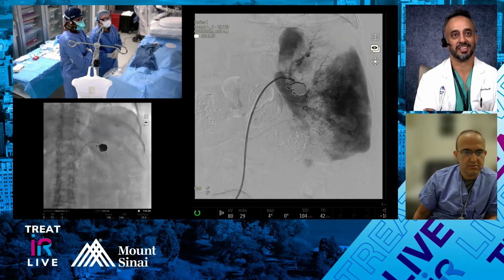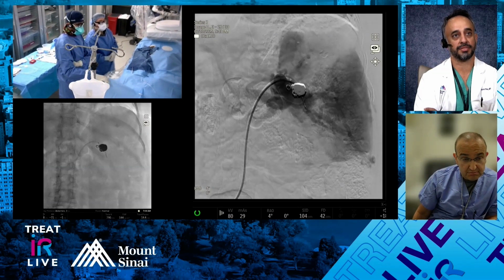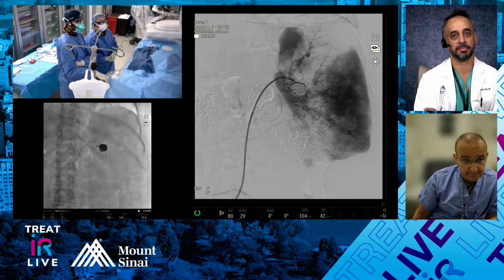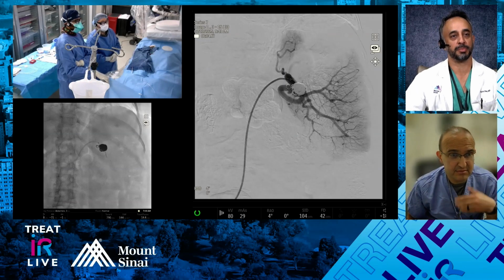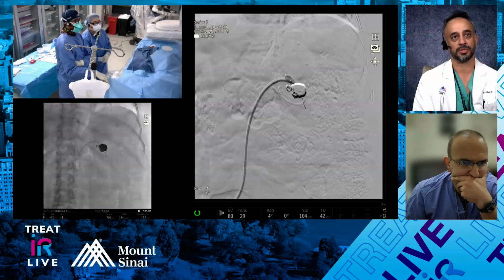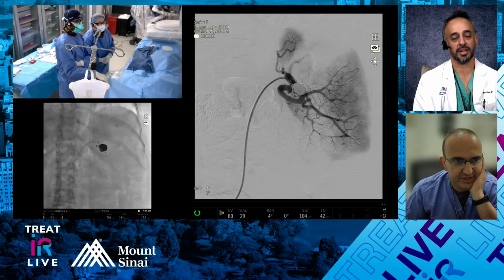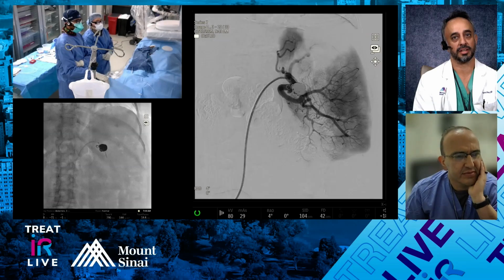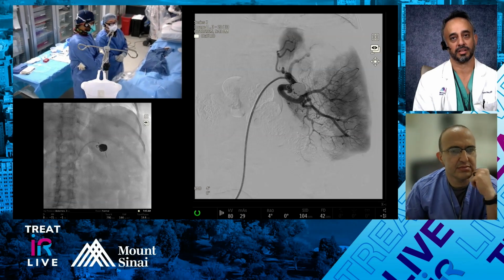So Ed, what do you think? What do you guys think? I think your aneurysm's closed, right? Clearly, because you have some infarcts, some malperfusion. Although I've also been fooled like this, where it looks malperfused, but when you bring it back and inject from the proximal splenic artery, there's actually collaterals filling those, especially from the left direction. Yeah, I agree with you guys. I think we're done here. Nice occlusion of the aneurysm sac.